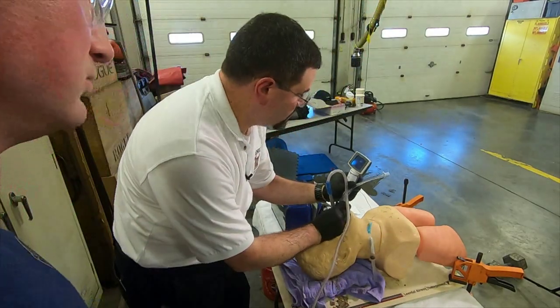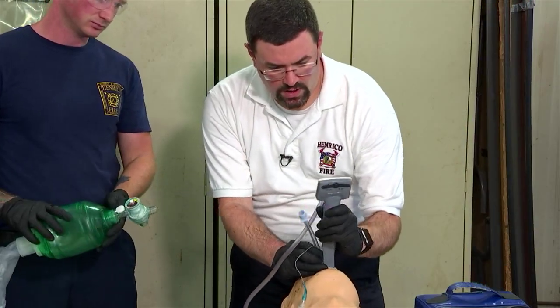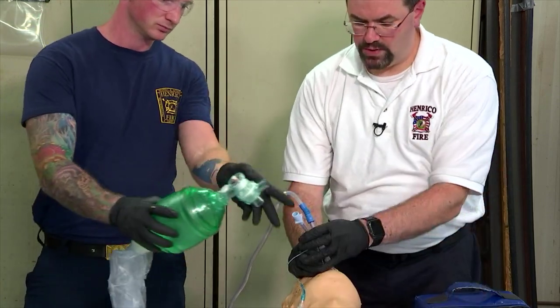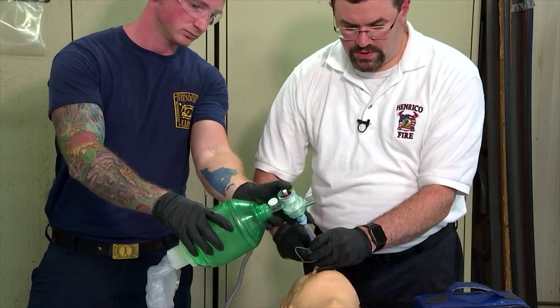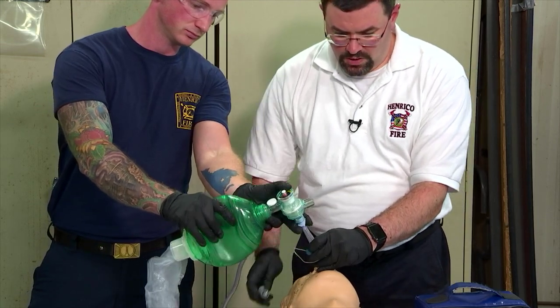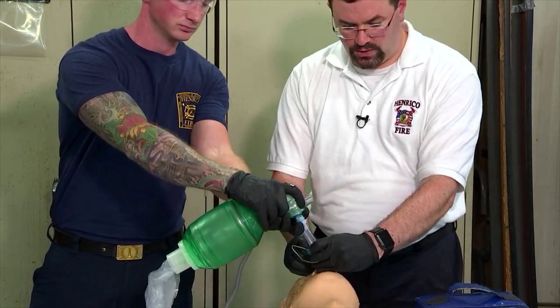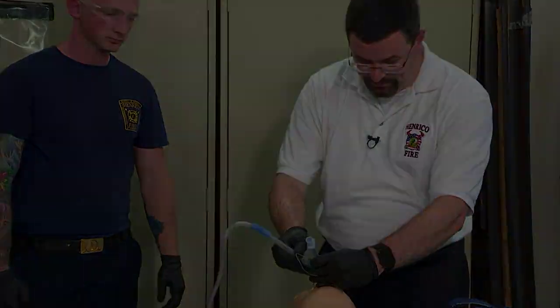And then once I'm in place, advance my tube in, peel that out to the side, and then Peter's going to bag for me. Now, let me get the cuff up there. Cuff is up. Good. So again, parking the end of that catheter just behind the cords into the top of the esophagus where the vomit or the blood should be coming from.